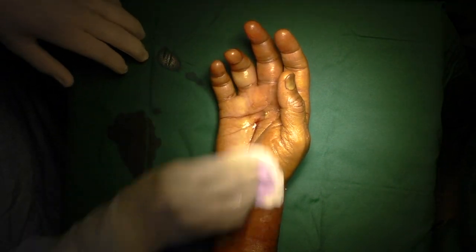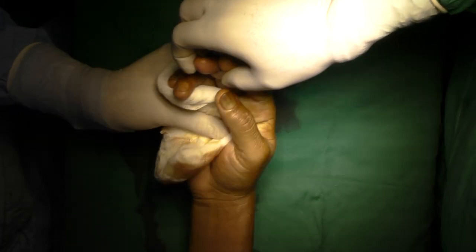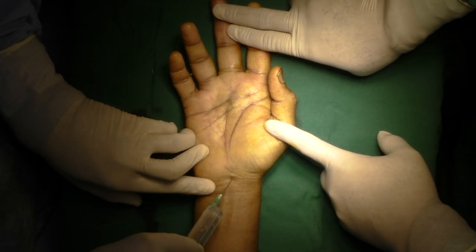Since he was having intense pain since last evening, we decided to take him to the operation theater as early as possible. He was operated under axillary block and arm tourniquet control. Tourniquet was raised after exsanguinating the limb.